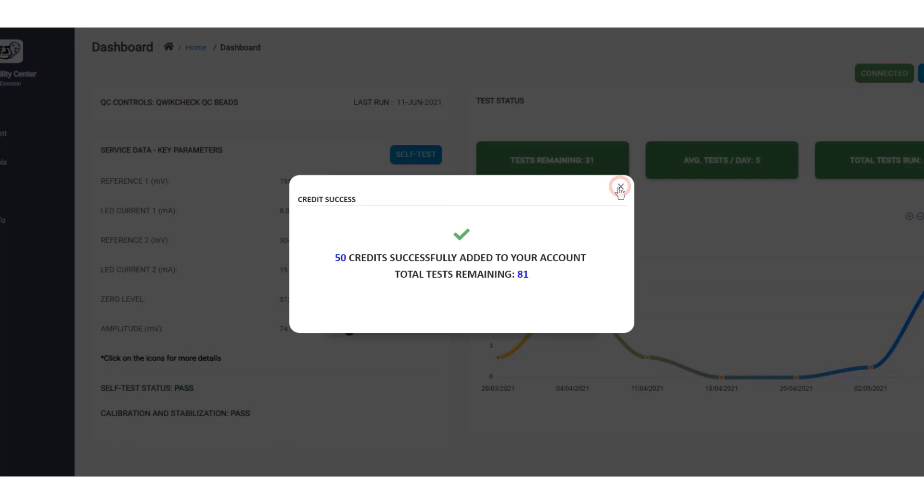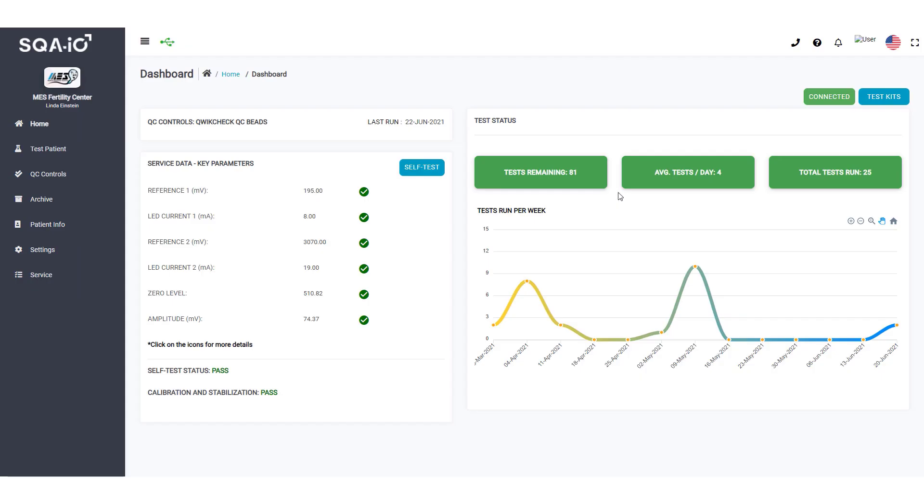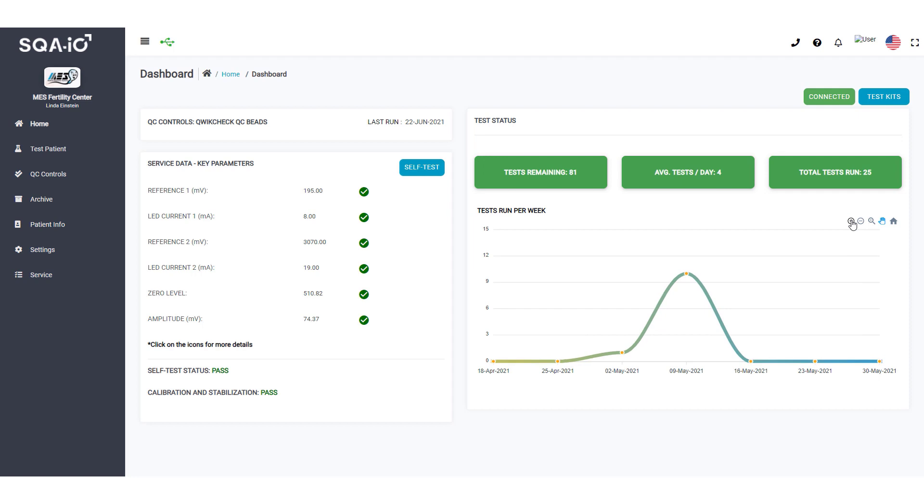Determine how many tests have been run on your SQA-IO this week. Zoom in to view the number of tests per day.